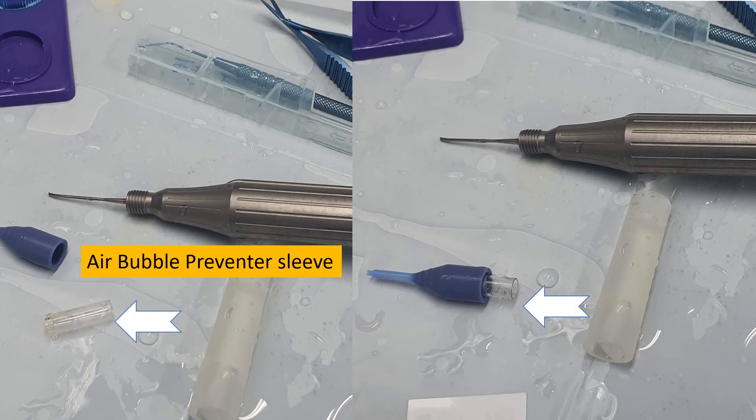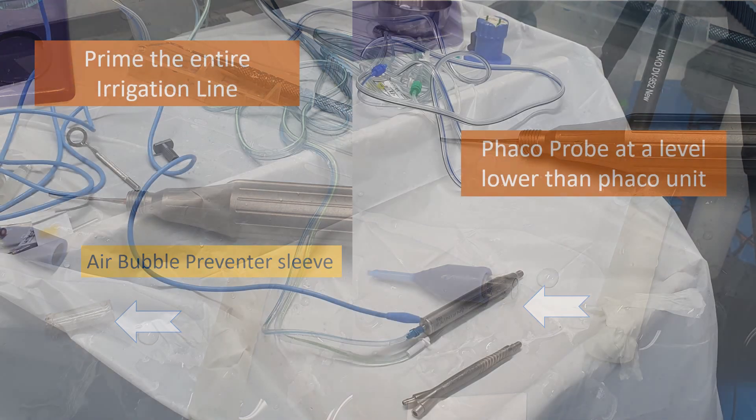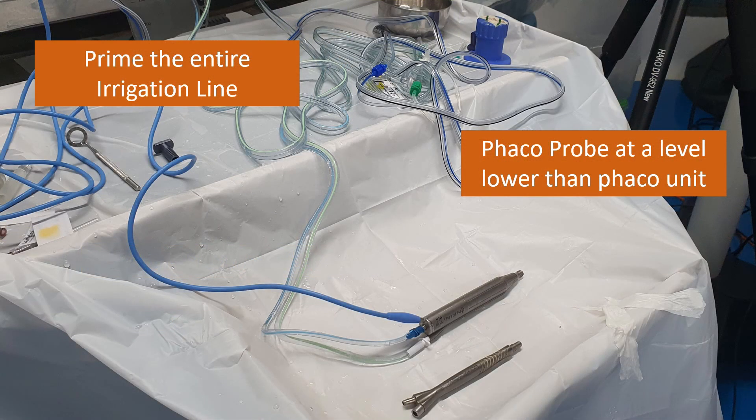This is a very important device called the air bubble preventer sleeve. It fits snugly inside your regular FECO sleeve. During FECO, when you are using high vacuum, a negative pressure is created around this sleeve, and if it is not airtight, air will leak through this gap into the anterior chamber. This bubble preventer sleeve exactly does that — it prevents air entry.